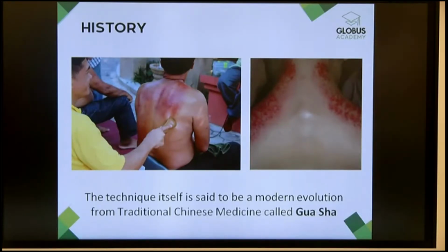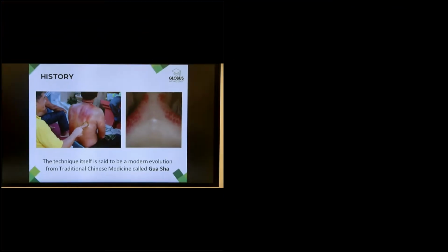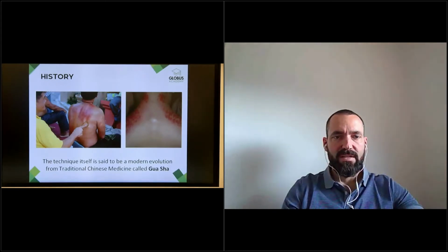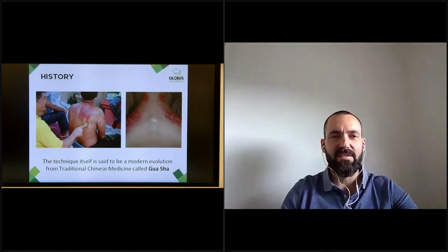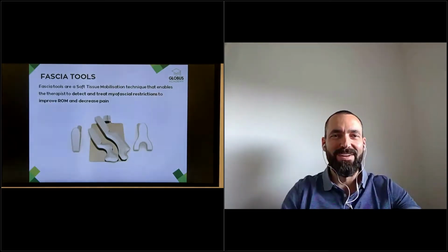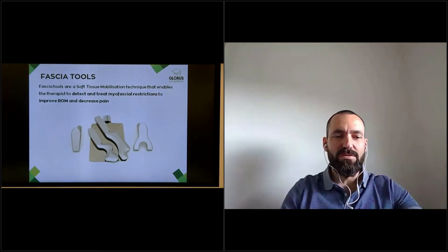First of all, I want to ask Diego if he's using these tools in his day-by-day practice. Yes, Enrico, I'm using all of them, mostly the DR trigger, because in my experience it's the one with which I can go more deep in the tissue, and I like deep treatment. But I use the others too. The spine maybe a little bit less.